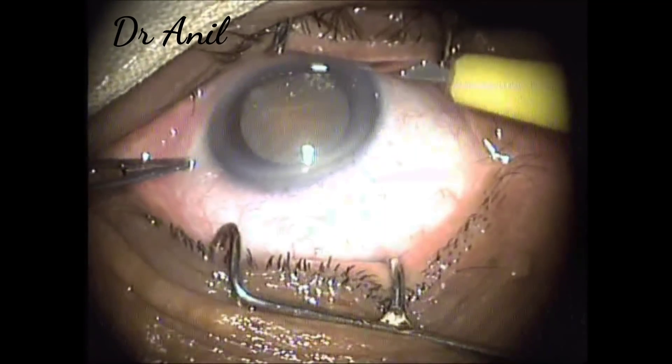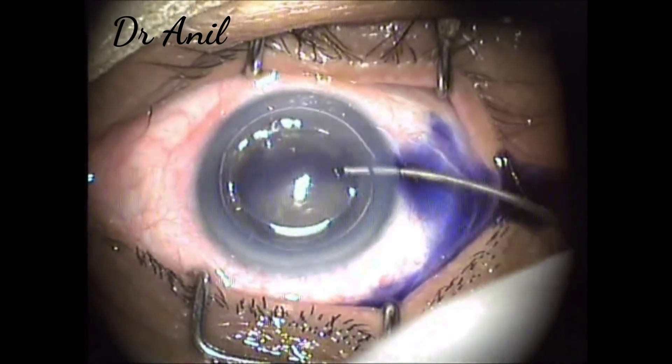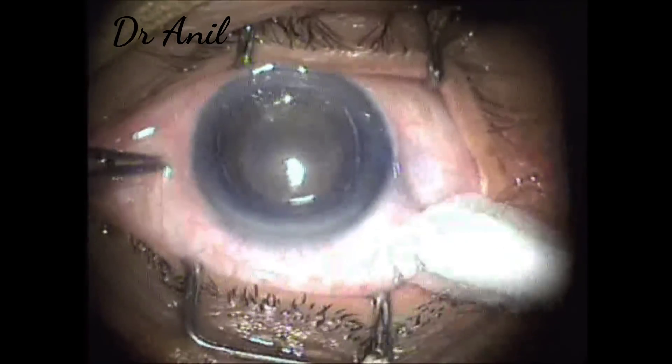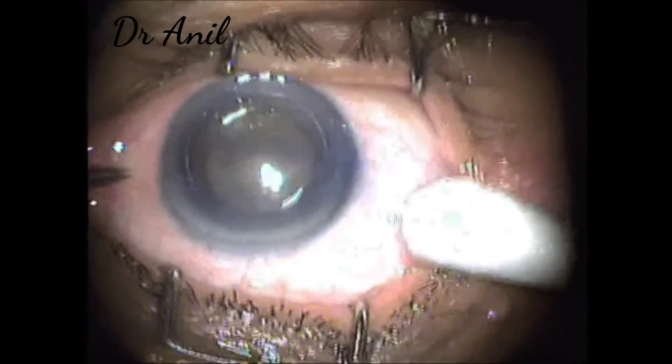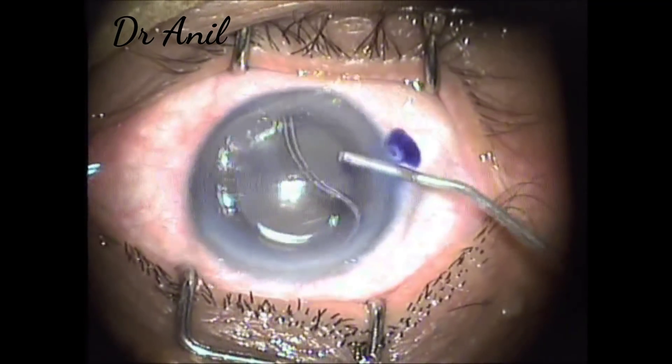In this video I just wanted to demonstrate how beautifully and how fast we can make a scleral tunnel. First of all a side port is made. Trypan blue is injected as there was no fundal glow, so trypan blue will stain the anterior capsule and it will become easier to make a rhexis.